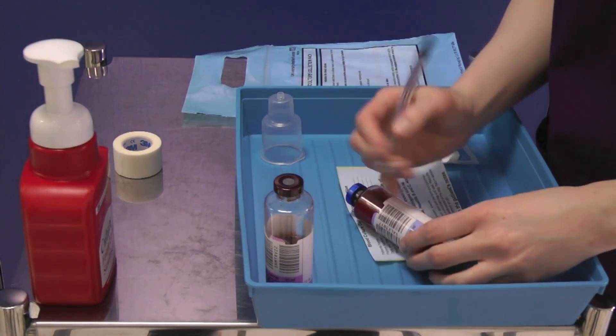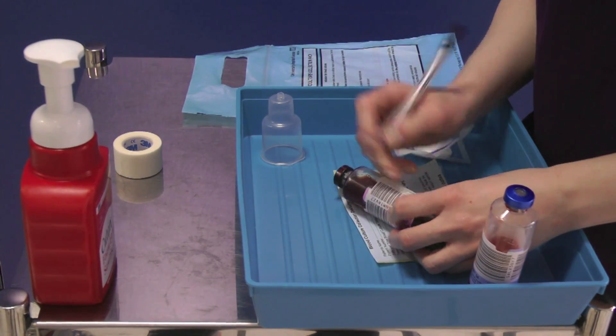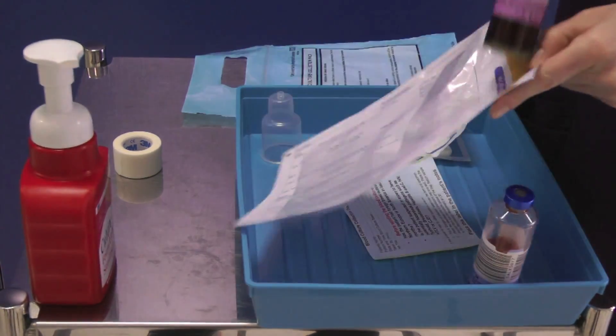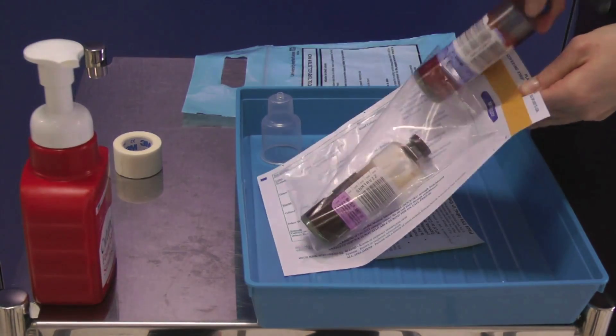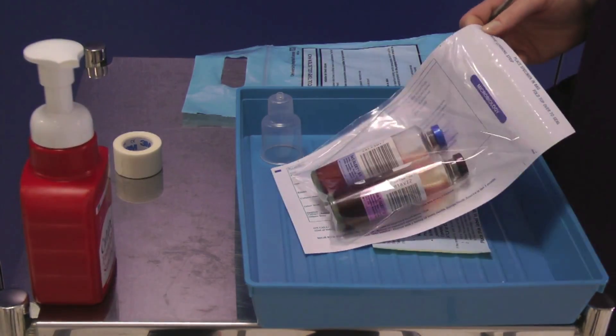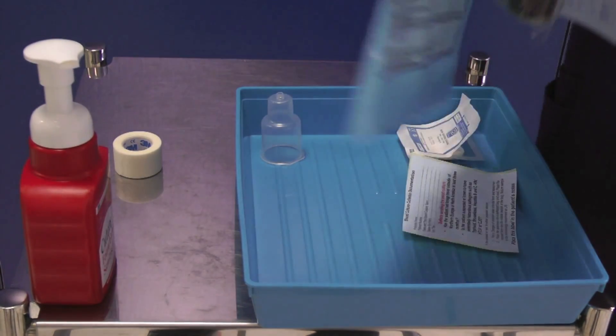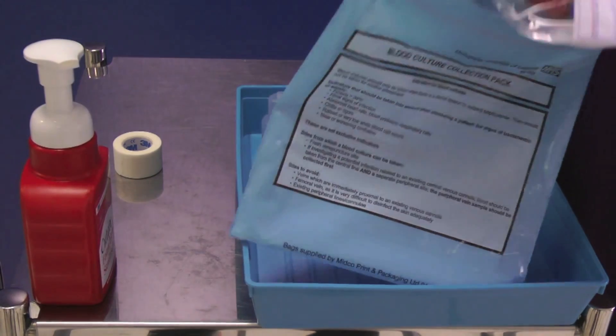Label the bottles at the patient's bedside. Place them into the request form bag. Place this into the blue blood culture bag and seal it.